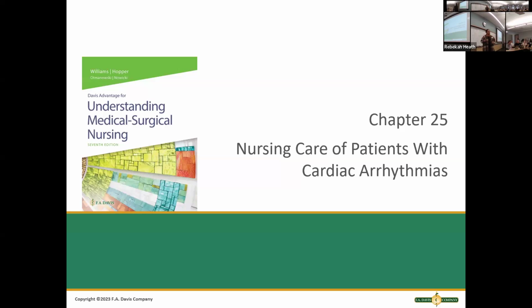We're not going to get super in depth. Have you gone over 12 leads in your lab class, how to do those, where you hook the 10 stickers onto patients? So 12 lead EKGs give you 12 different views of the heart. We're just doing simple EKG interpretation. 12 leads are a lot more complex. If you go on to get your RN or further degrees, you might learn how to interpret those. But we're going for simple EKG interpretation.